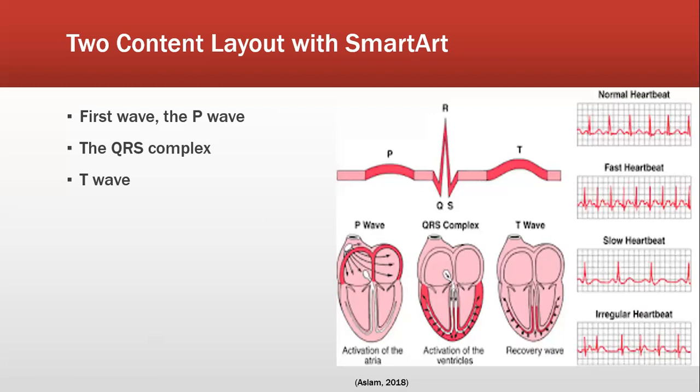The T wave at the end here indicates the ventricular repolarization, in which the ventricles relax following depolarization and contraction. The ST segment refers to the gap between the S and the T wave and represents the time between ventricular depolarization and repolarization. An elevated ST segment is a classic indicator for a myocardial infarction.